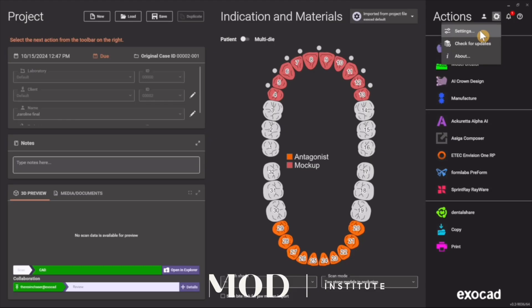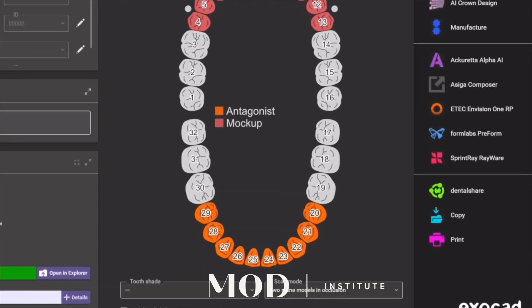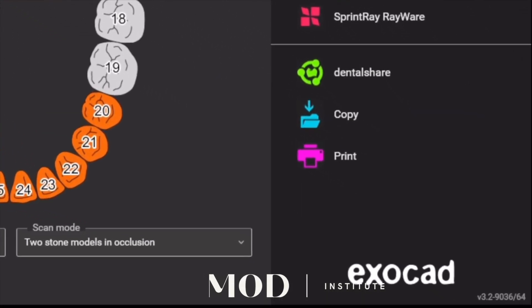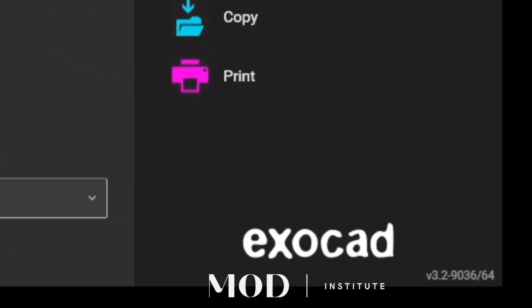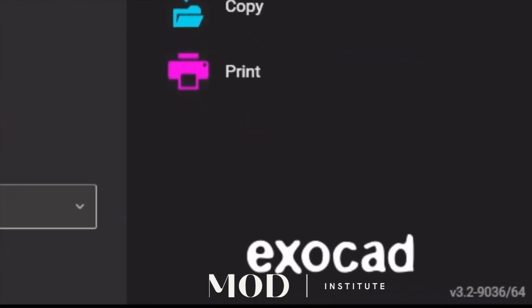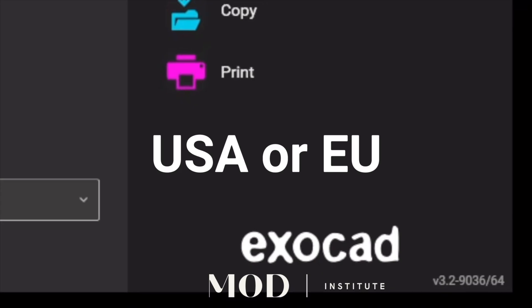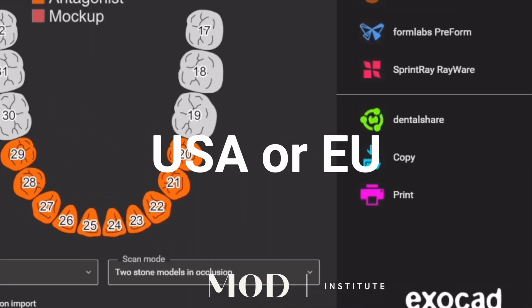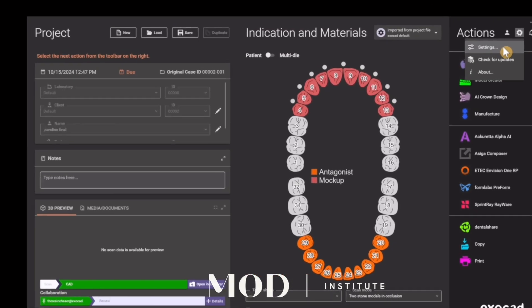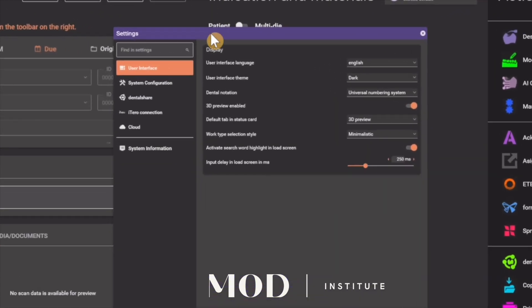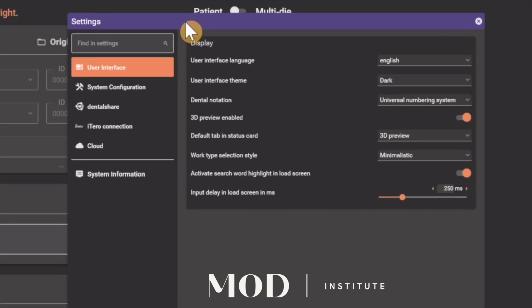Let's go through the settings you need to change to enable AI in your ExoCAD. The first thing is you need to be on a newer version of ExoCAD — build 9d36 or later — be in the USA, and you need to be active in your subscription.